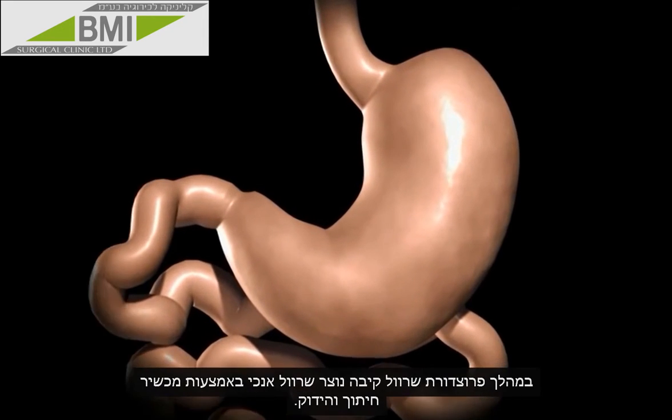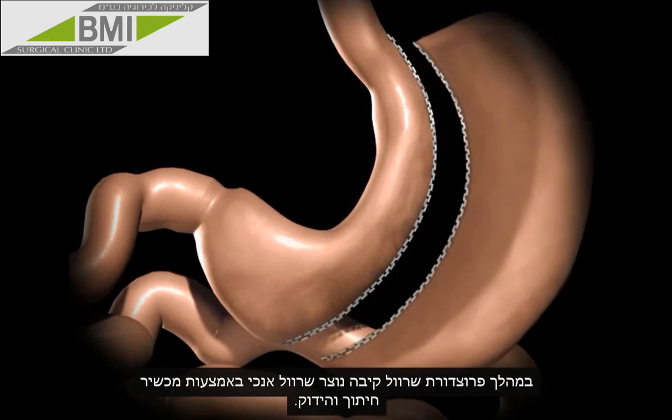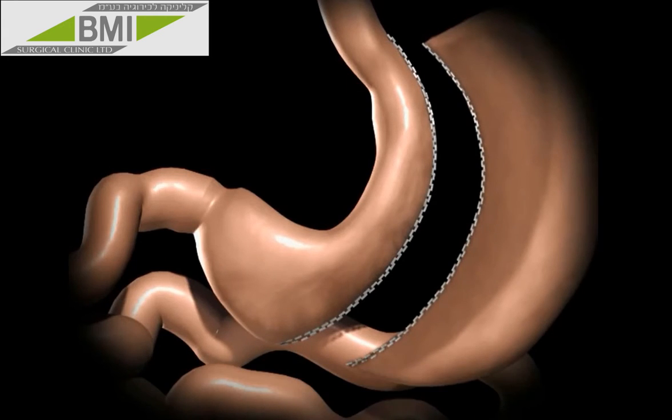During a sleeve gastrectomy, a thin vertical sleeve is created by using a stapling device. This sleeve will typically hold between 50 to 150 milliliters, or is about the size of a banana. The excised portion of the stomach is removed.